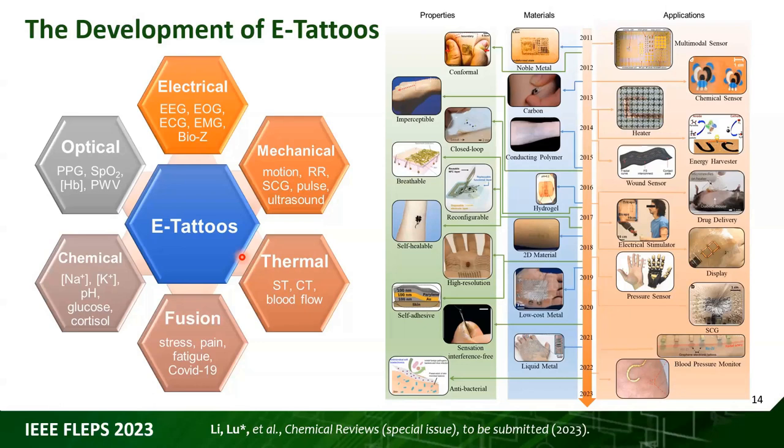Currently for device papers, people try to demonstrate cycling beyond at least 1,000 cycles, sometimes 10,000 cycles. So it is still a challenge. And not just the device itself, sometimes the interface between the device and the rigid components is the most vulnerable. So I will talk a little bit more about the integration and the interfaces.